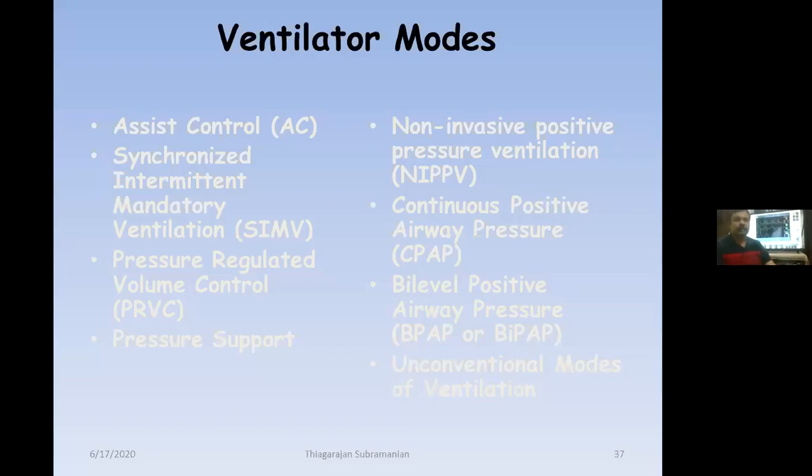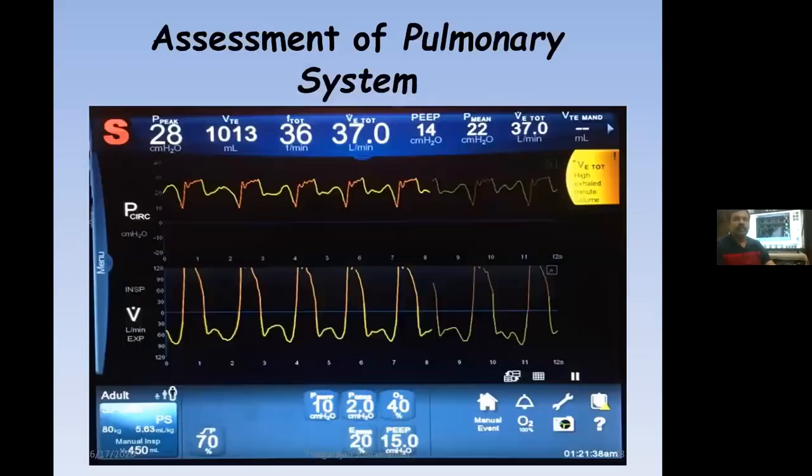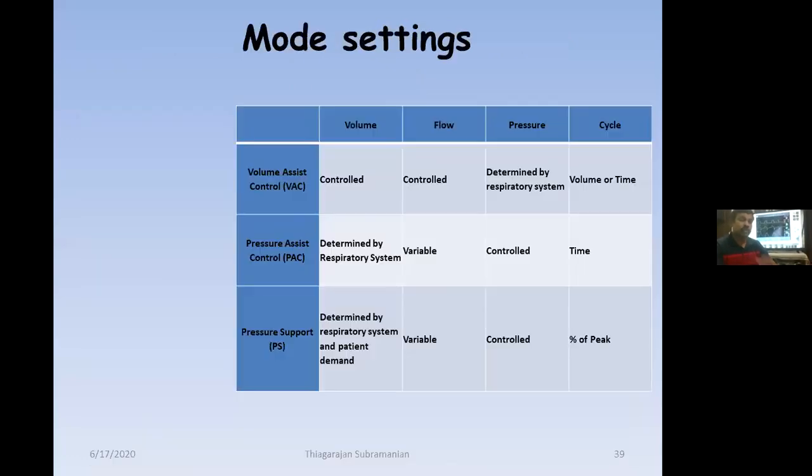Okay. So this is the important thing. Every day we have to assess the complete set of these parameters. It is mandatory to check the pulmonary system, and it is mandatory to check the mode settings. This is the outline map of this mode of settings.